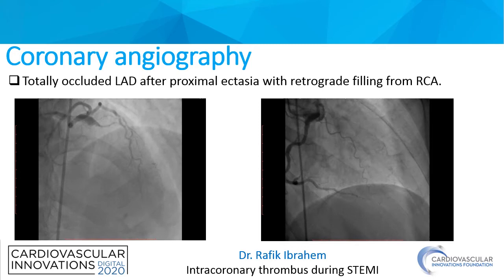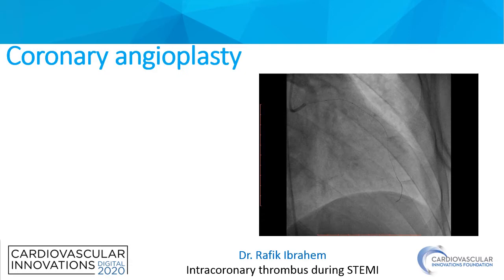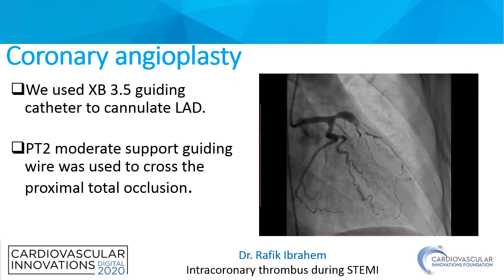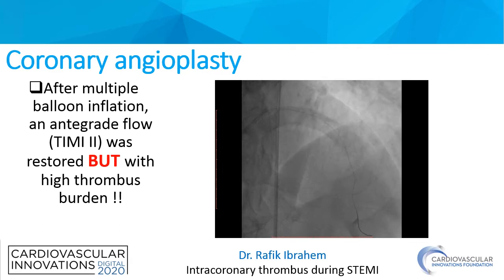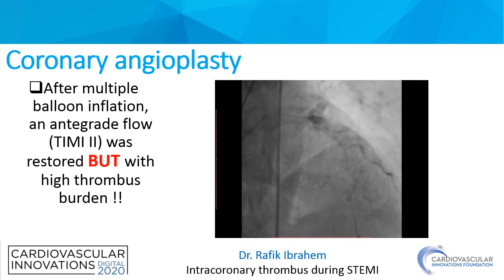Coronary angiography showed total occluded LAD after proximal ectasia with retrograde filling from RCA. For coronary angioplasty, we used an XP guiding catheter 3.5 to cannulate the LAD, and a PT2 moderate support guiding wire was used to cross the proximal total occlusion. After multiple balloon inflations, antegrade flow TIMI 2 was restored but with high thrombus burden.